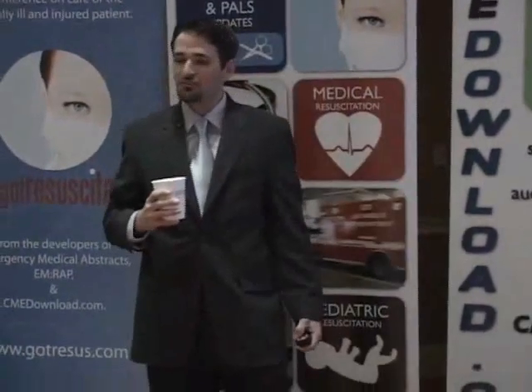2 centimeters or less is normal. Greater than 3 centimeters is a AAA. In a symptomatic patient, you want to assume that the symptoms are being caused by the AAA until you can prove otherwise.